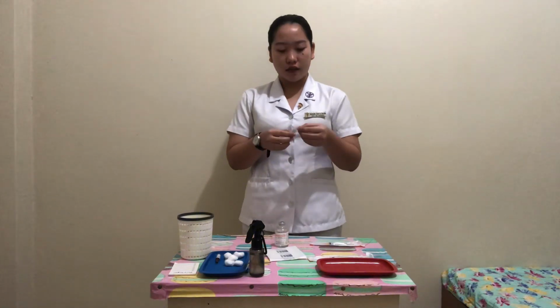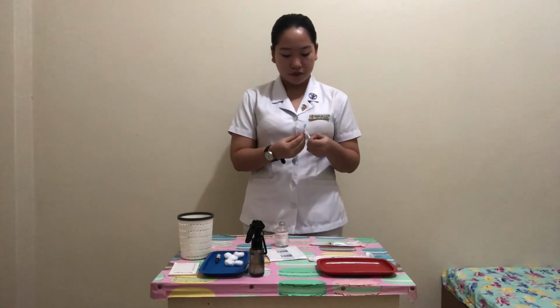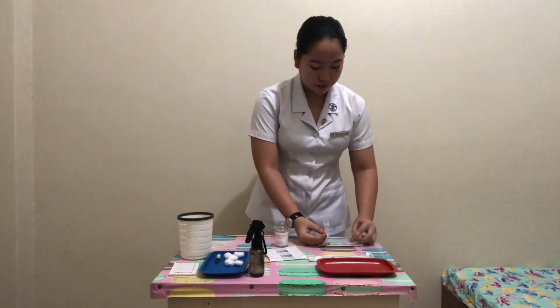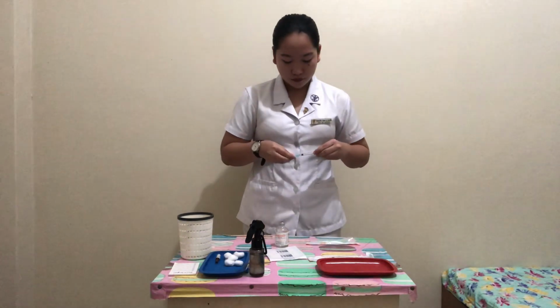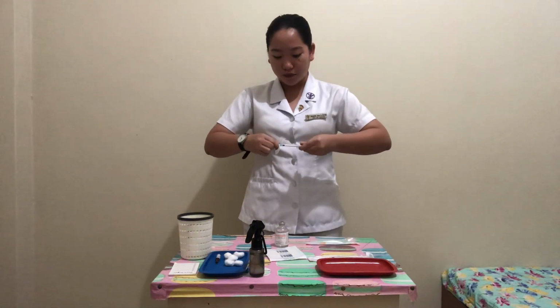Then open the package of the aspirating needle and connect the barrel of the syringe to the aspirating needle. And also secure that and ensure that the connection isn't loose.